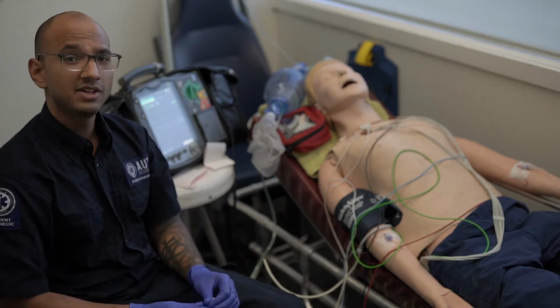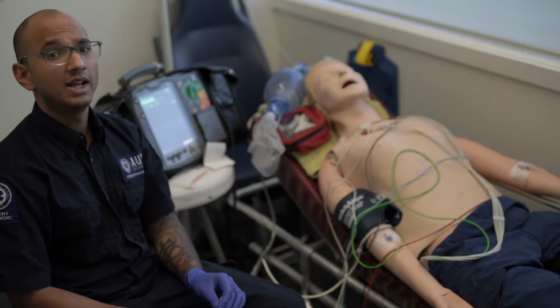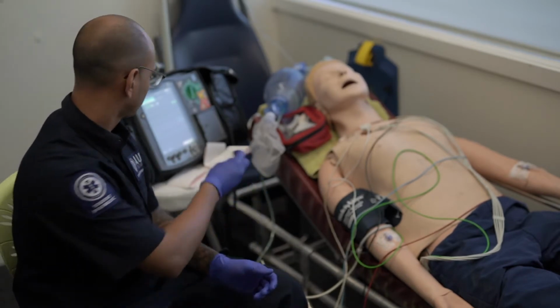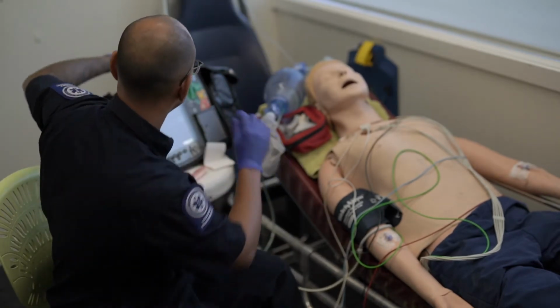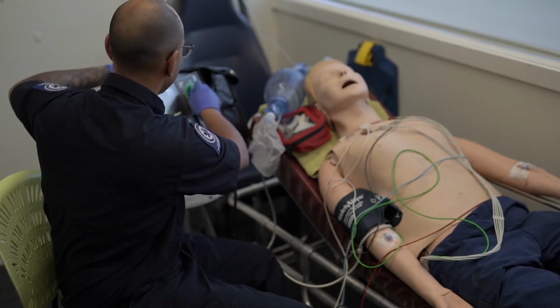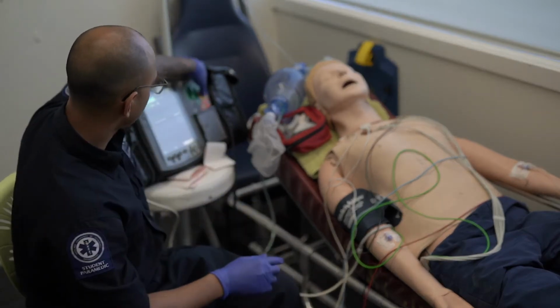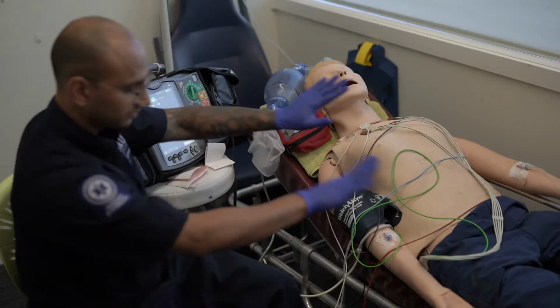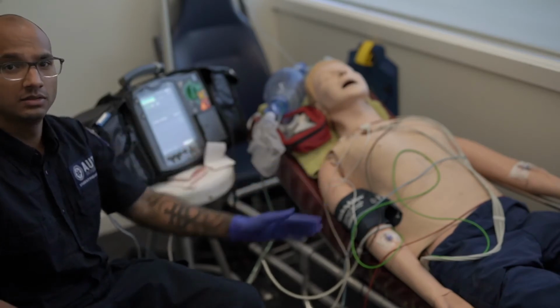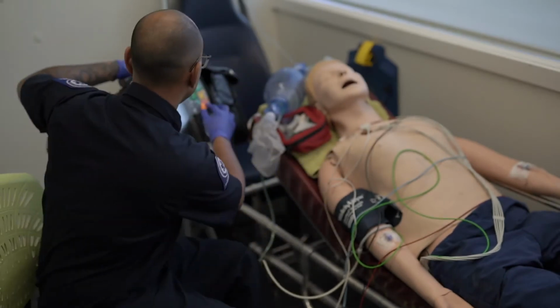Now, because our patient is unable to obey any commands, he does not require any sedation. Select the joules, charge the defibrillator and confirm everyone is clear. Selecting joules to 150, charging the defibrillator, ensuring everyone is clear. Press and hold the shock button until the shock is delivered.